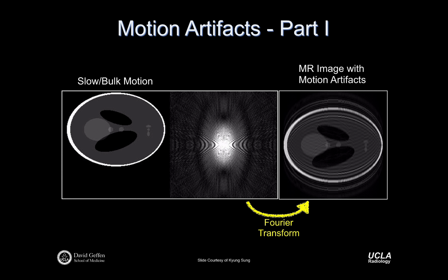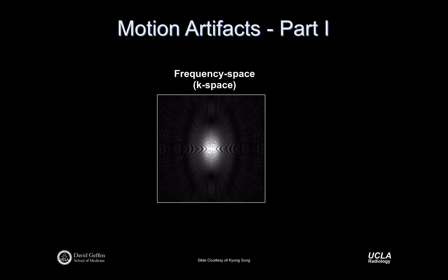And it stands to reason, but maybe I didn't say it explicitly, that it's going to be a phase encode artifact, right? We try to make the distinction when we can between phase encode artifacts and frequency encoding artifacts. Somewhat remarkably, and the Lauterbur book goes into this in more detail, if there's motion left-right during frequency encoding, it has a far smaller impact on the resultant image quality as compared to moving around in the phase encode direction during acquisition.